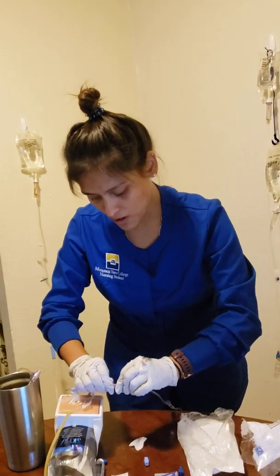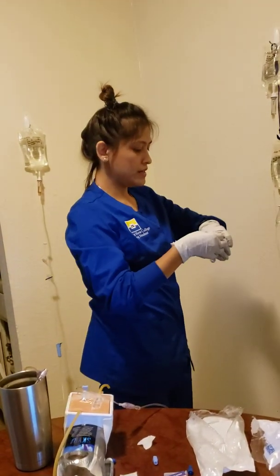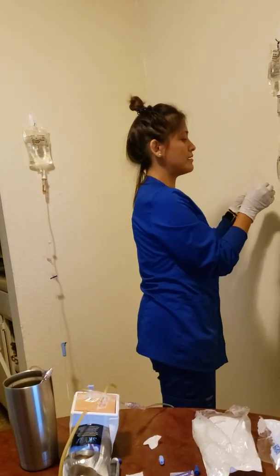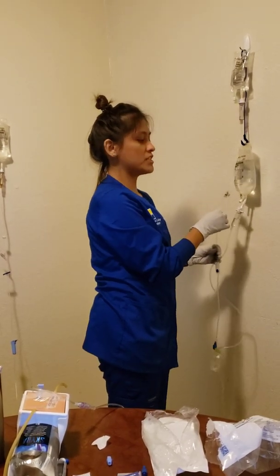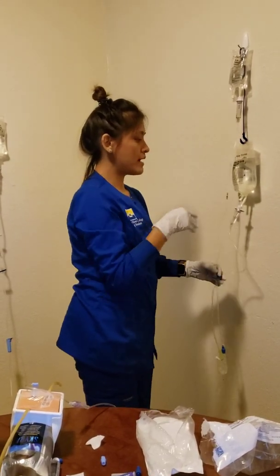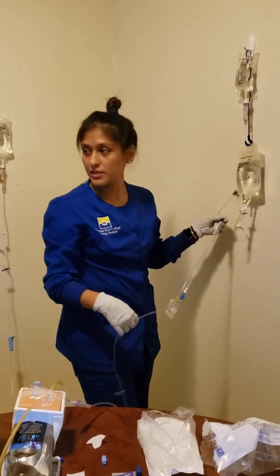And I'm also gonna wanna go ahead and label my tubings. So I've already done a name, initial, and time. Initial, date, and time. And I'm gonna just put this on both of my tubings, to be changed in 96 hours. And if it had any sugar or any additives in the saline or the med, I would change it every 24 hours. So that's good. Everything is still clamped.